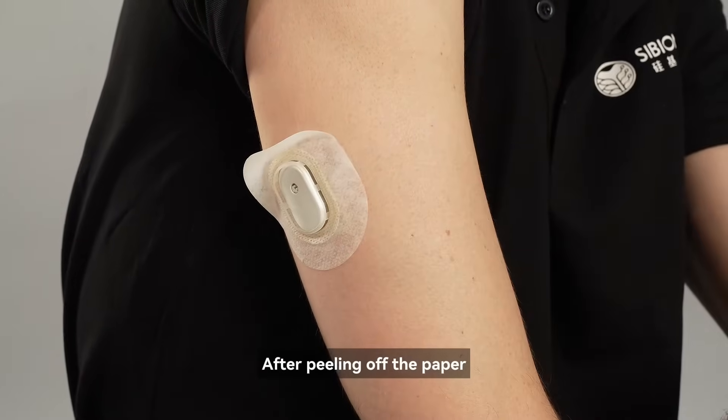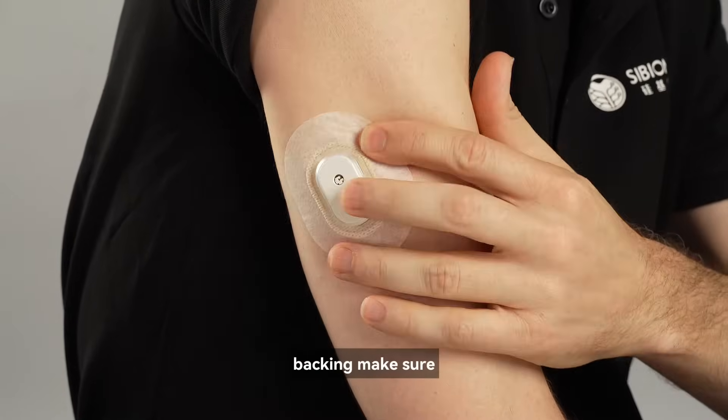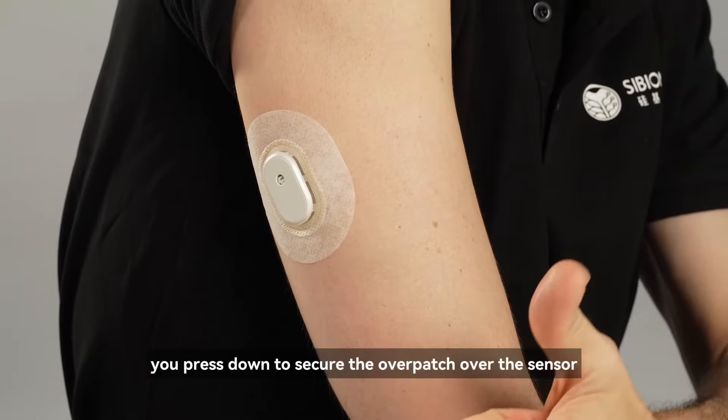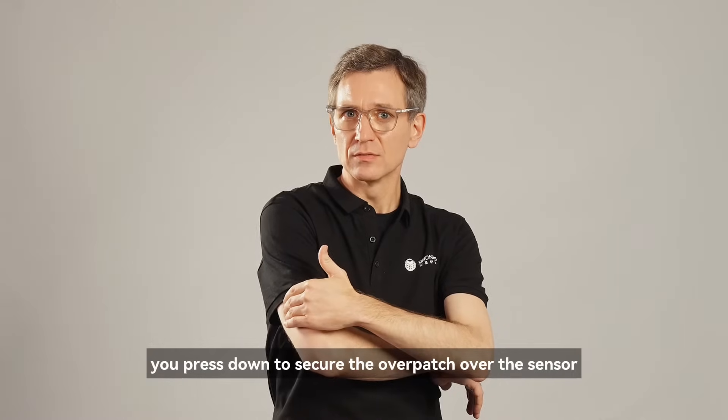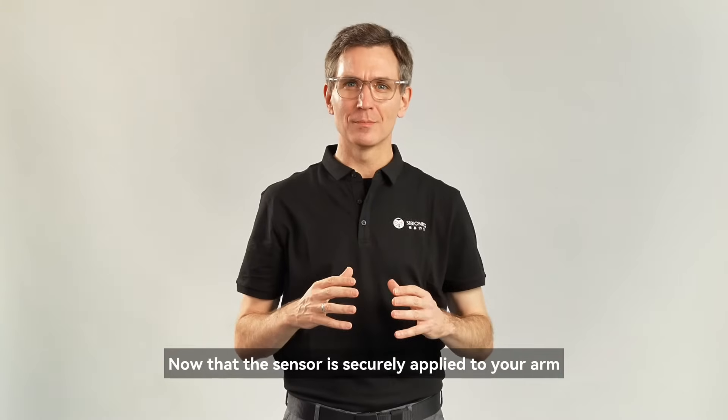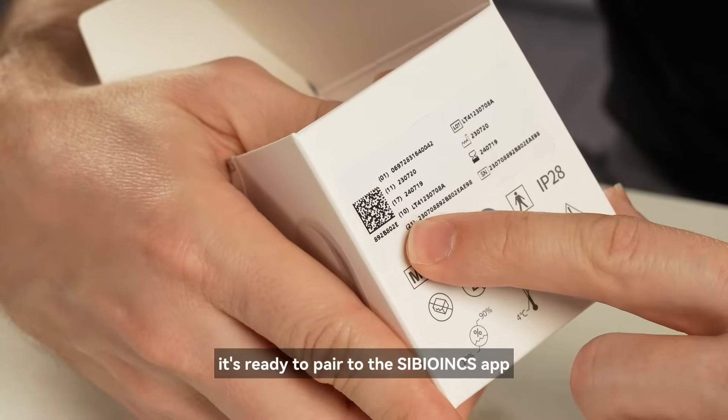After peeling off the paper backing, make sure you press down to secure the overpatch over the sensor. Now that the sensor is securely applied to your arm, it's ready to pair to the Cybionics app.